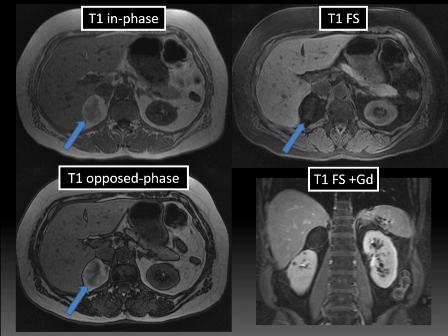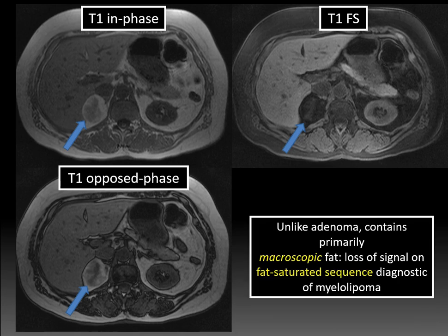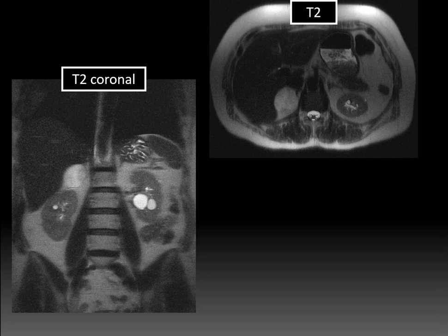On the T1 fat-saturated post-gadolinium image, the mass is only slightly enhancing — the fat signal areas are not enhancing — which is typical for myelolipoma. Only the soft tissue components enhance. Note also that it's well-circumscribed, unlike a liposarcoma, and it's separate from the right kidney — it's not an angiomyolipoma. Unlike adenoma, myelolipomas have primarily macroscopic fat, meaning they'll lose signal on the fat-saturated sequence, which is diagnostic of myelolipoma. You can think of macroscopic fat as fat you can see on CT — you can put an ROI on it and get negative 30 to negative 90 Hounsfield units. Contrast that with adenoma, which has microscopic intracytoplasmic fat that loses signal on the T1 opposed-phase image. Even though MRI is very specific for myelolipoma, CT with visible macroscopic fat may be more straightforward, as you can see it evident on a single image.